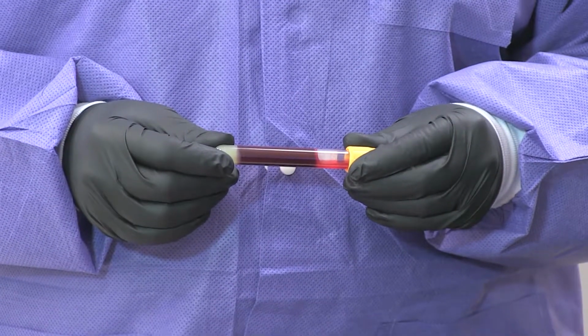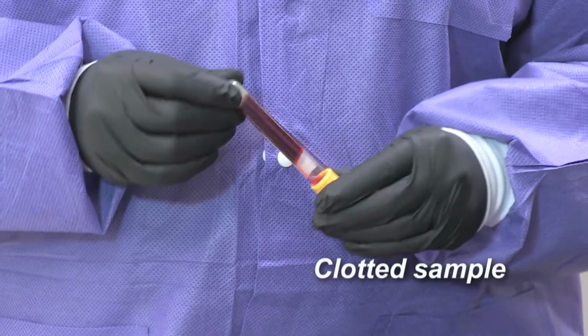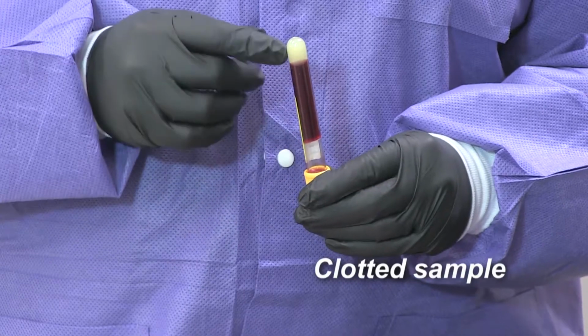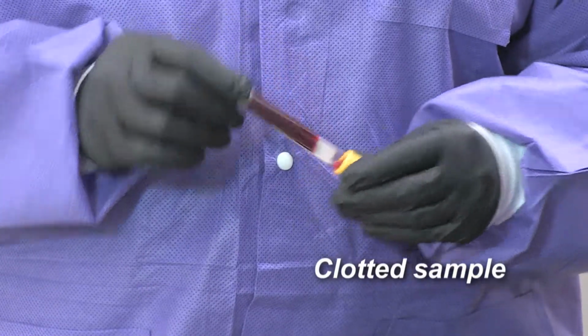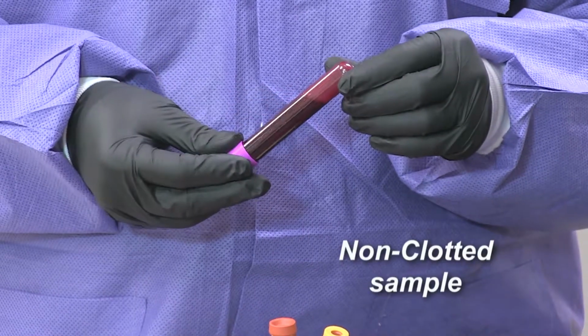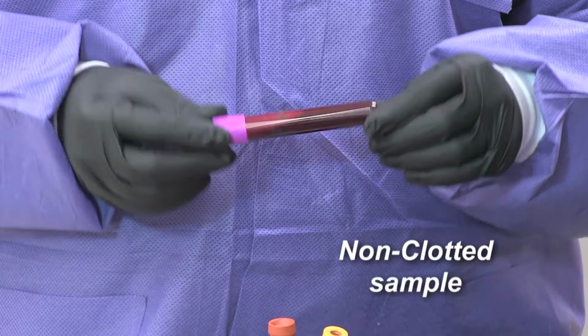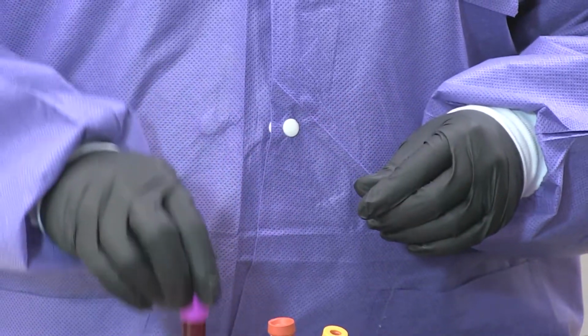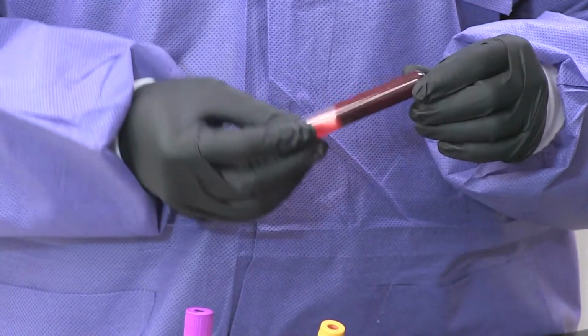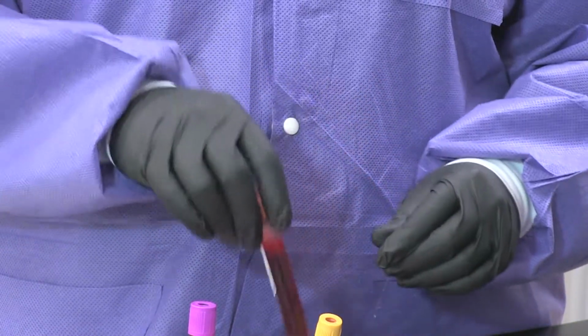Before centrifugation, you need to check to make sure the sample is clotted. A clotted sample will not move up and down the tube. It is one solid piece. I am using an EDTA tube to exemplify a non-clotted sample. As you can see, it is free-flowing and not one solid piece. Before the centrifugation, you need to make sure that it is one solid piece.